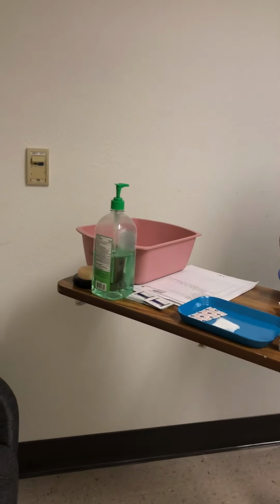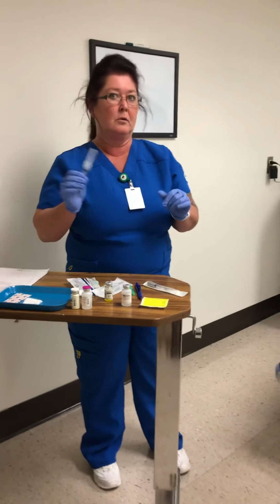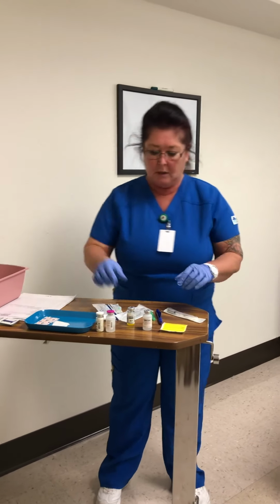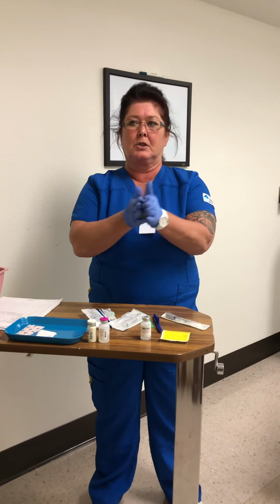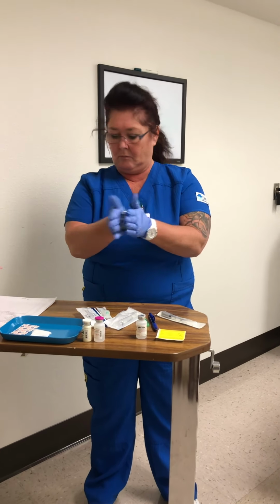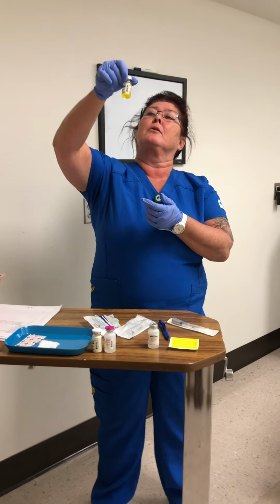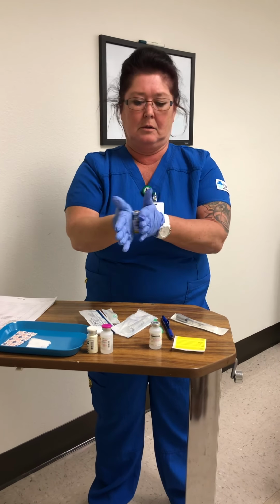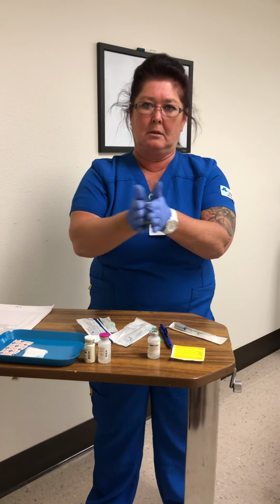And I'm going to recap. And this is going to go into the sharps container. To mix this, I'm going to gently roll this between my hands. And we're going to check to make sure all the powders have dissolved. We want to make sure that the color is correct for what it should be.